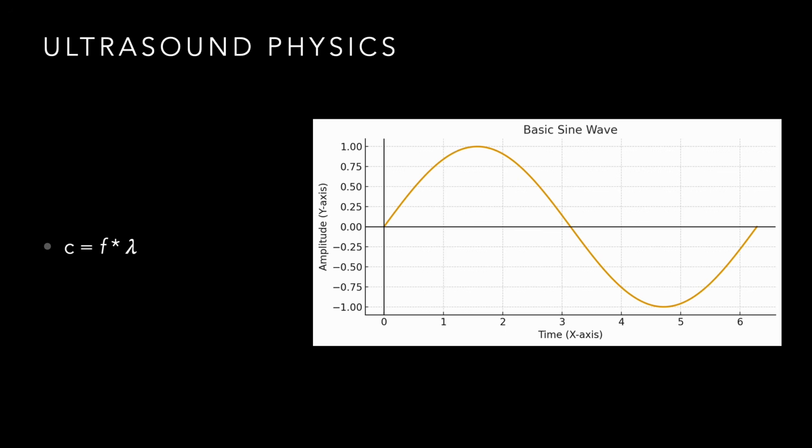And so if we use that as our number, then we can take the frequency that we're transmitting, that's going to translate into a wavelength, that sound wave that acts like this sine wave that I see depicted here. And so when we understand this, we're going to come back to this basic model of this wave, this sine wave, this wavelength as kind of this fundamental principle.